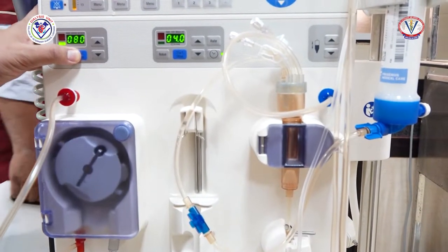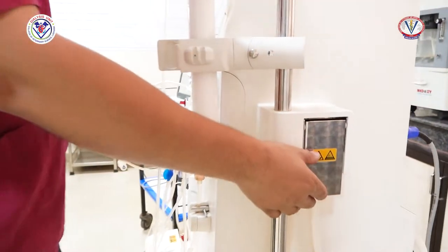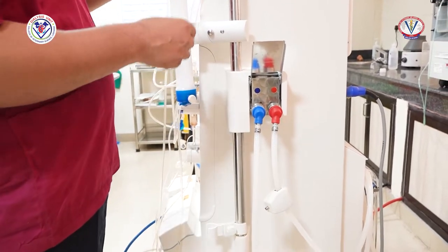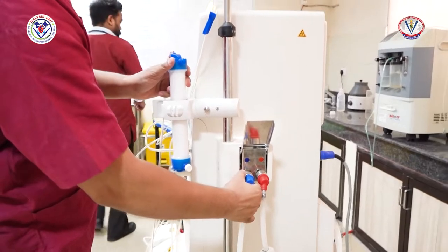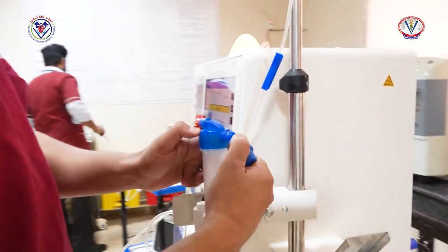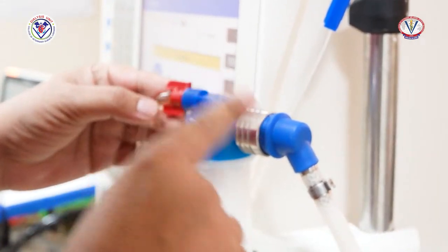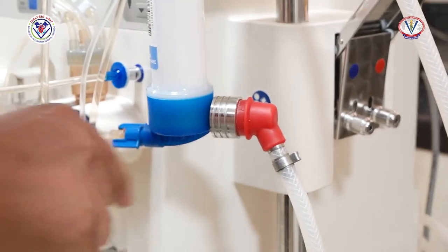After recirculation of heparin for 5 minutes, stop the blood pump and connect the dialysate couplers with the dialyzer. Make sure to connect the red and blue coupler lines in opposite directions to the blood tubing. That is, the red blood tubing port will have a blue coupler and the blue blood tubing port will have a red coupler. This will allow countercurrent flow of blood and dialysate for effective clearance.